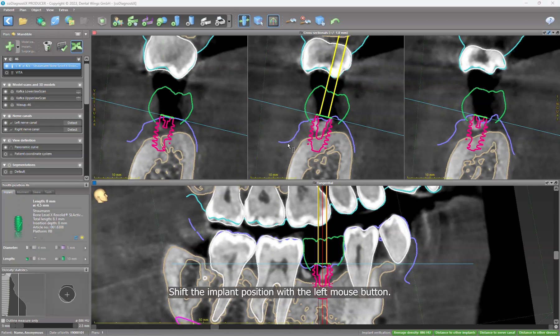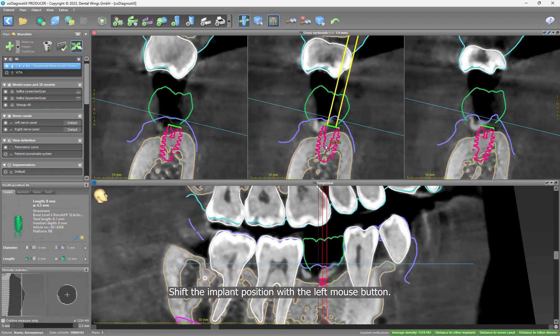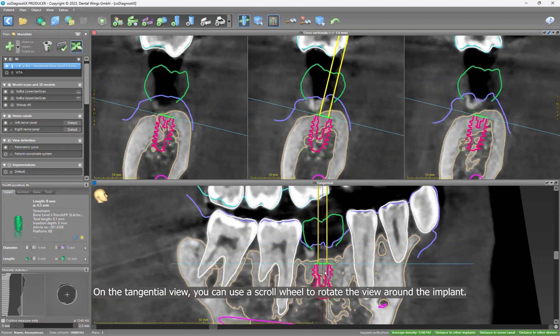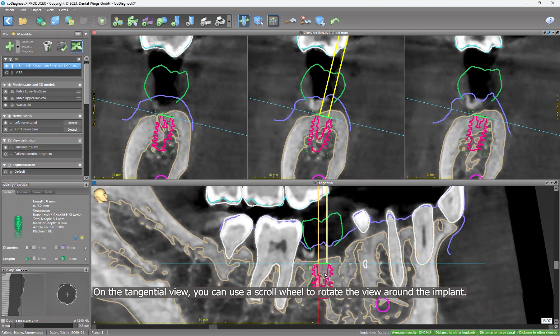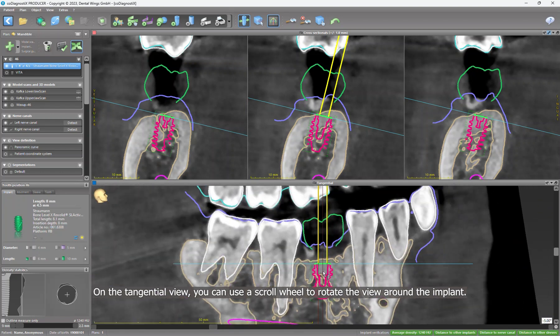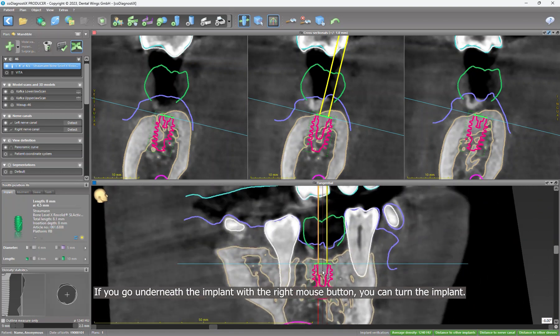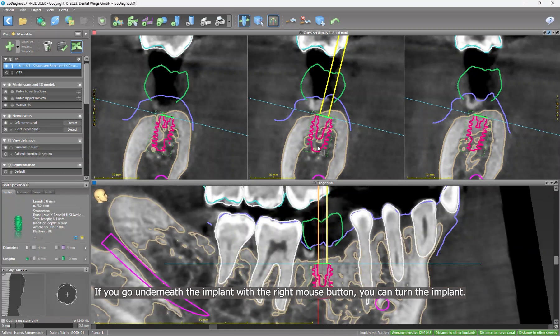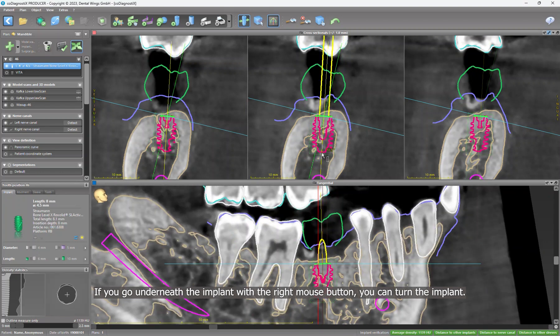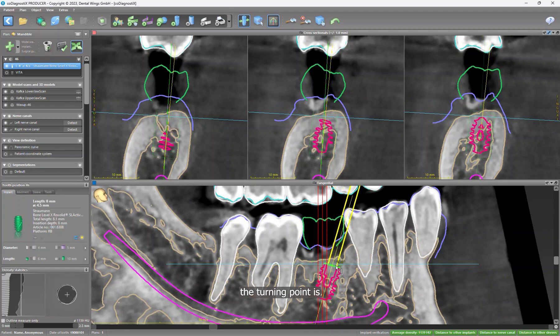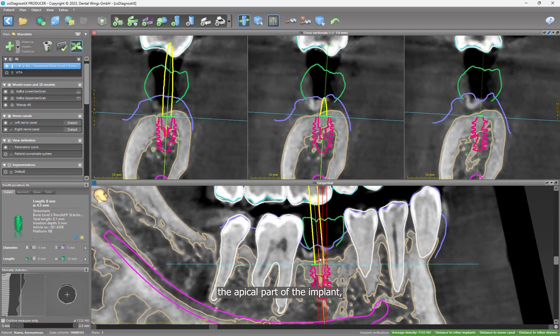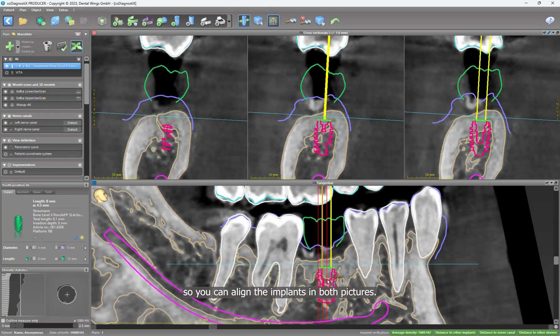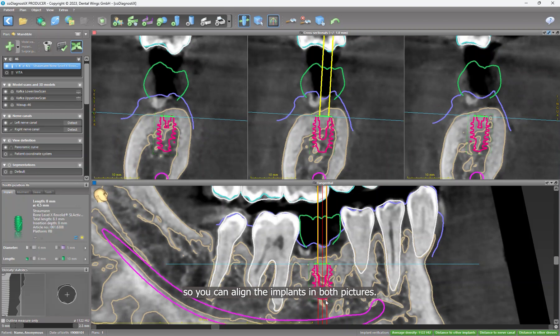Shift the implant position with the left mouse button. On the tangential view, you can use a scroll wheel to rotate the view around the implant. If you go underneath the implant with the right mouse button, you can turn the implant. If you go on top of the implant, the turning point is the apical part of the implant.